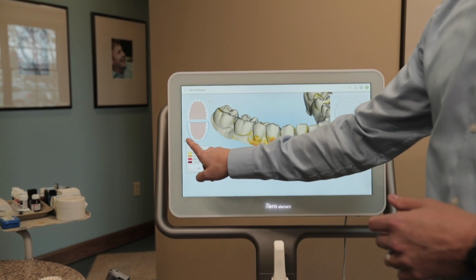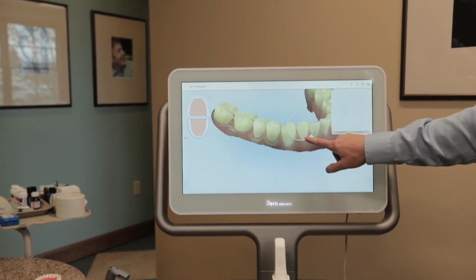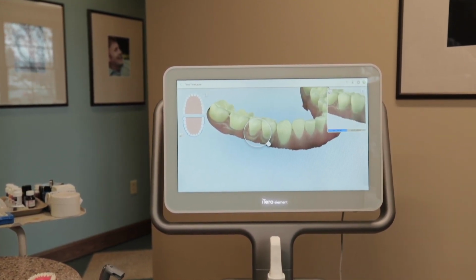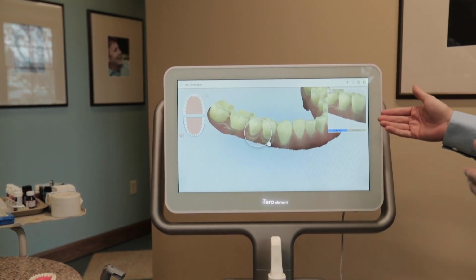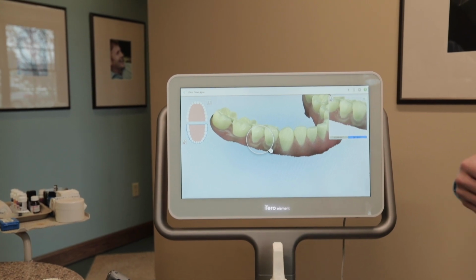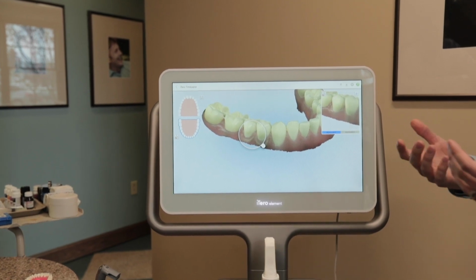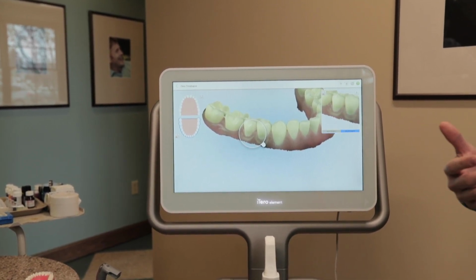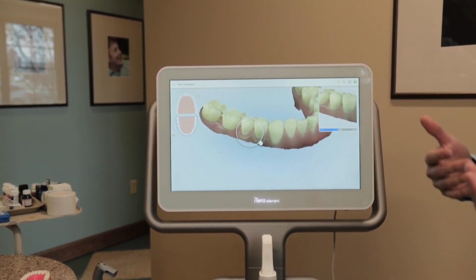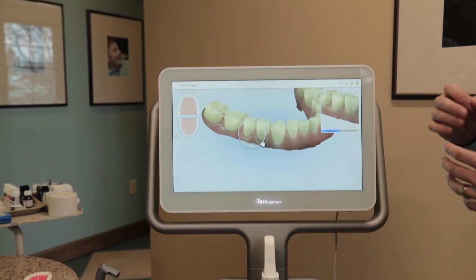Seeing is always believing. Here I'm going to turn this on to color, and now we're going to look at this gingival recession. Again, this is a typodont, but the theory and the concept is that we're now showing the patient what's happening to their gingival surface and how it's receding. Again, using those -ing words to indicate that it's not something that happened, it is happening. And now we can get into the root cause of what's going on and talk to them about how we can potentially save them significant time and money and pain by getting into treatment earlier rather than later. That's what we're all about, doing it minimally invasive and trying to save the patient as early as possible by noticing it.